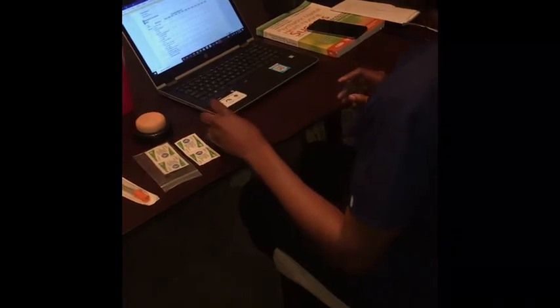Then I'm going to start with my first check, which is to check the medication on the MAR. The medication I have to administer today is insulin, regular insulin, 58 units subcutaneous, at 8 o'clock. My patient's name is Jan Doe. The date of birth is 1/23/27. So for this, I have to make sure that I have the right patient identifier, right route, right dosage, right time, do perfect documentation, and check for any allergic reaction.